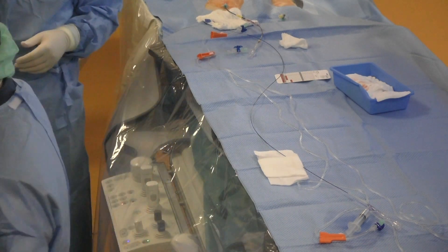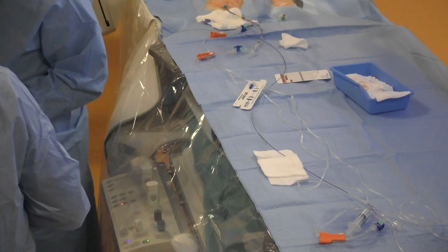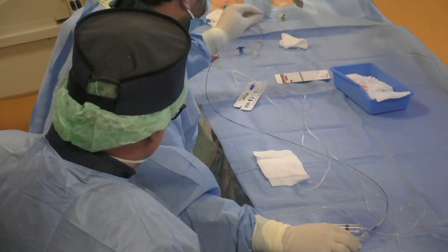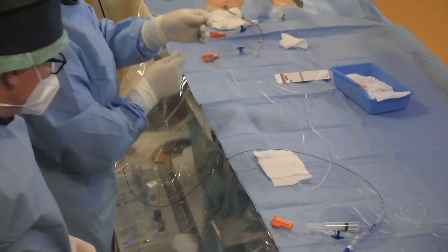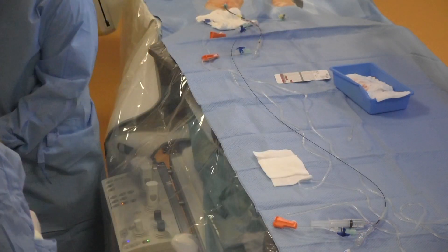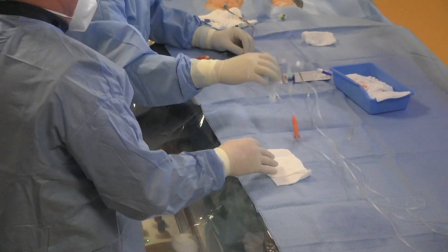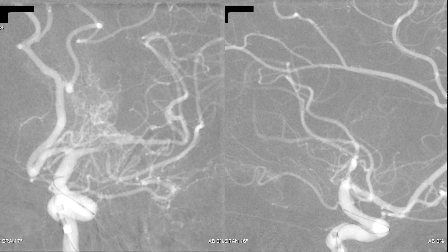Now we are waiting for the micro wire — Synchro 14. We insert it into the back of the balloon microcatheter. Here we are shaping the tip of the micro wire with the shaper; we only need a little curve on the tip. Now we are inserting the balloon microcatheter with the micro wire and starting to navigate the distal parts of the left ICA.